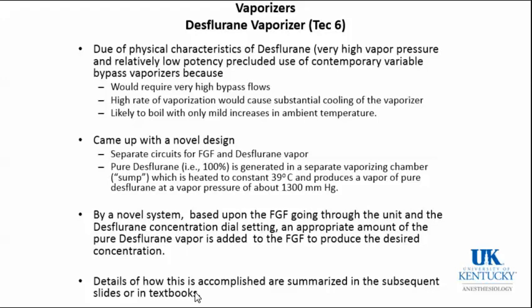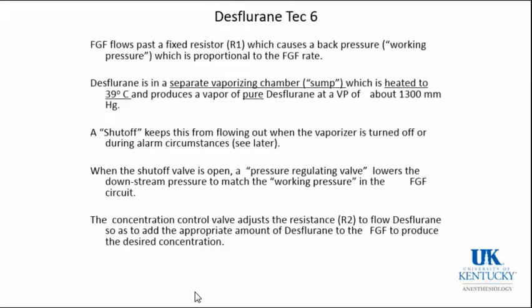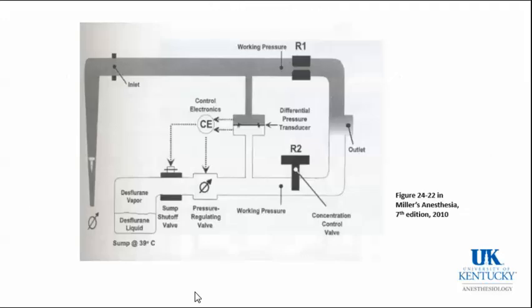So they had to come up with a new type of vaporizer for desflurane. And this is how it's described, but basically it has two separate chambers.